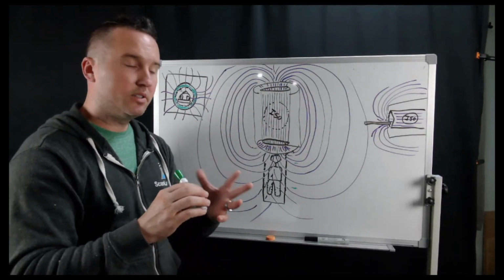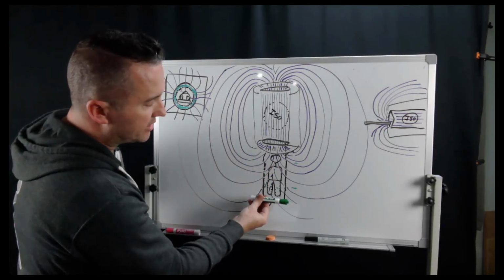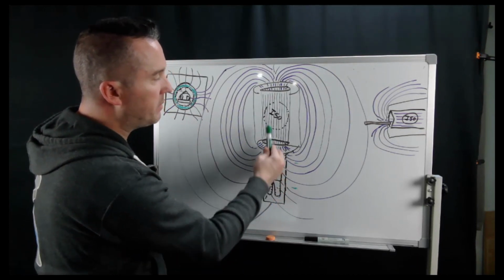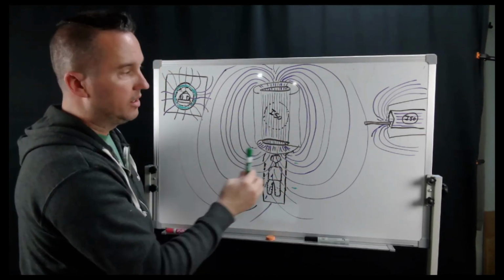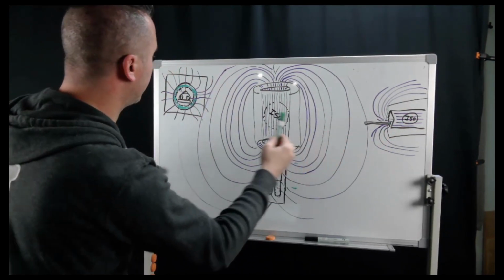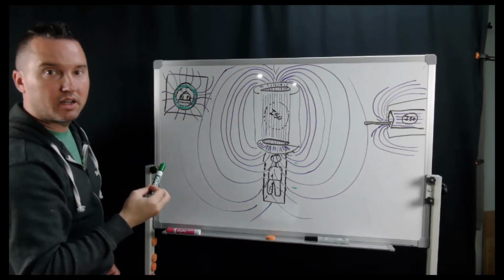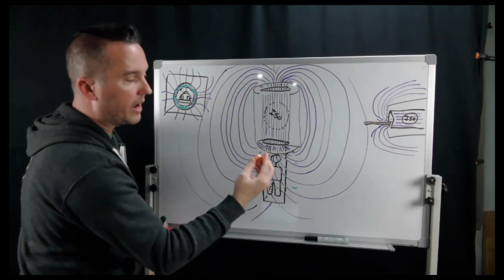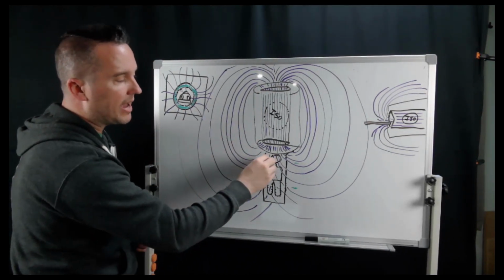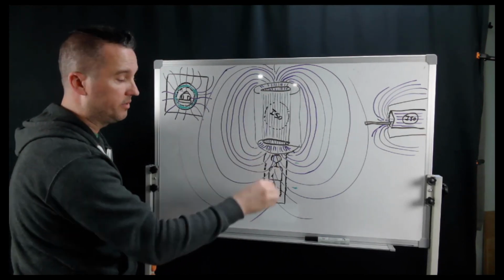However, we have rotational force. Rotational force is what happens if we have something with a long axis and I take it inside of here: it would try to align its long axis to be parallel with the lines of flux. If I took it here, it would try to align parallel with the lines of flux. If something were a spherical object, and I were to put it inside of here, there is no long axis, so there would be no rotational force on this object.